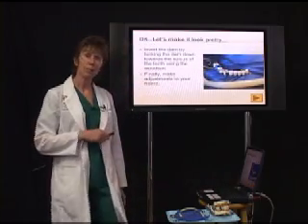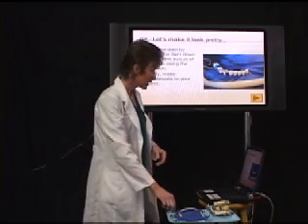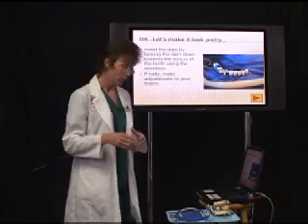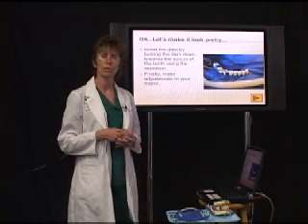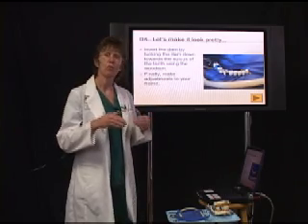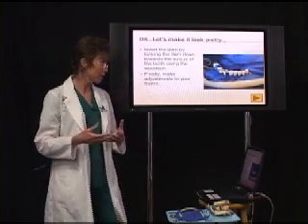The last step is to invert the dam by tucking it down towards the sulcus of the tooth. You're going to use your beaver tail instrument or your Woodson to do this. This creates a nice seal — the whole reason for the dam is to keep saliva out of your working environment.